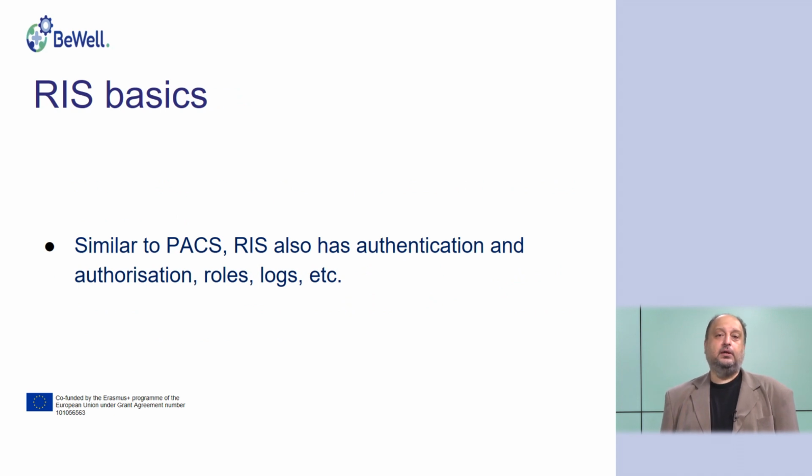Similar to the PACS, RIS also has authorization and authentication, roles, logs and so on to monitor the activity and to perform security measures.